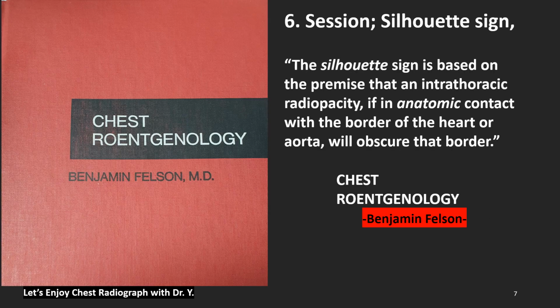Have you ever seen or read this book named Chest Röntgenology, written by Dr. Benjamin Felson? This is a classic book about chest radiographs and still a fantastic, wonderful book. This is session 6 about the silhouette sign.